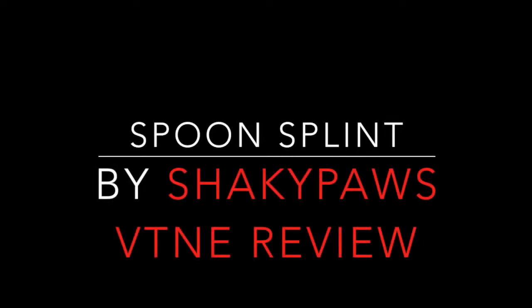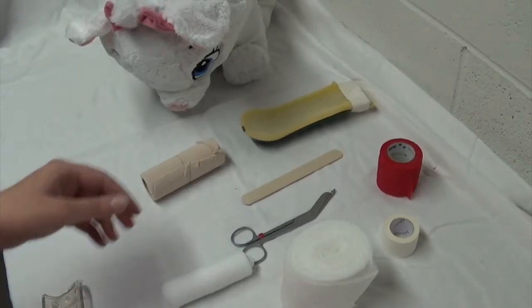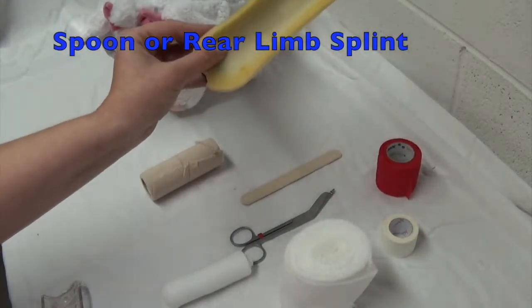Welcome to Spoon Splint Application presented by Shaky Paws. Some of the materials you're going to need for a spoon splint is, of course, going to be the spoon splint itself.